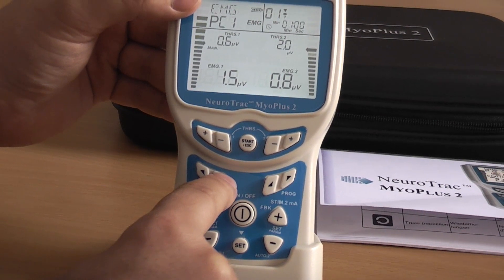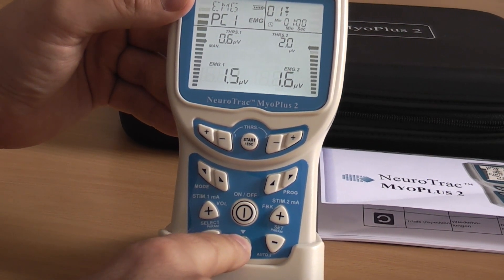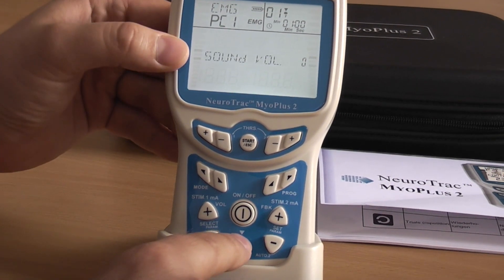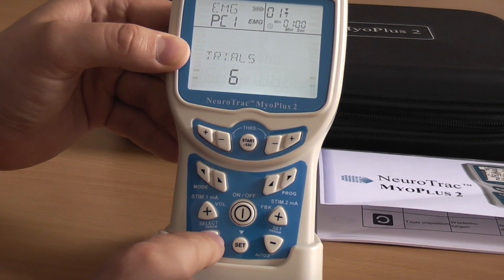Press Mode to go to EMG Custom. Here, press and hold Set, and here you can see all the available settings: work time, rest time, number of repetitions, and many more.